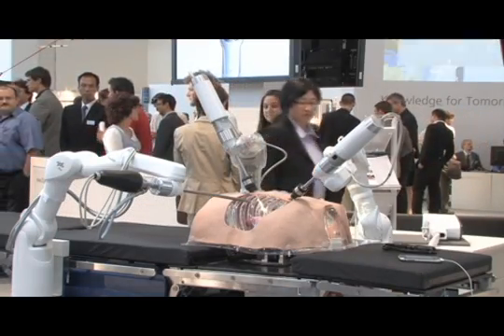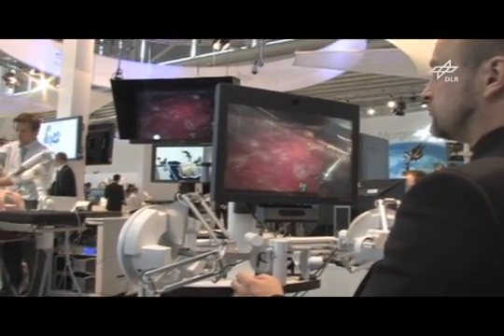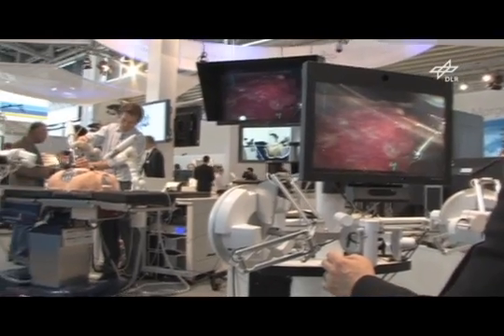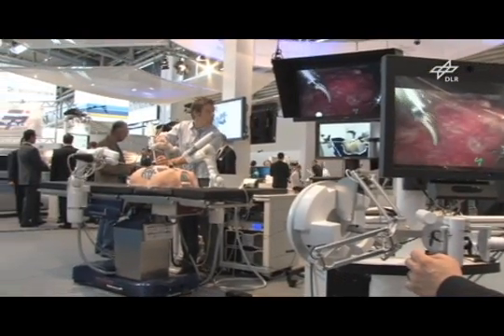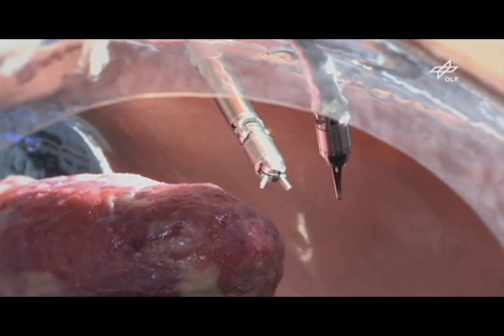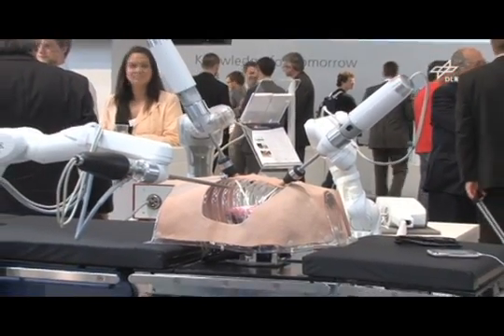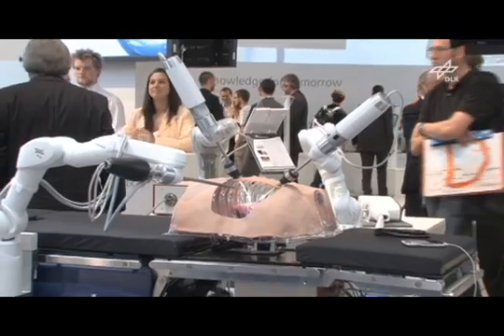For the future, we imagine assisting functions such as the automatic tracking of heart motion, or augmenting the surgeon's field of vision by overlaying additional information such as pre-operative patient data, to give the surgeon better guidance. The aim is to provide MiroSurge to the clinics in the future. The many benefits that will arise from this system in the years to come can already be seen now. Nevertheless, there clearly remains a way to go from the certification of the system to the surgery on humans using MiroSurge.